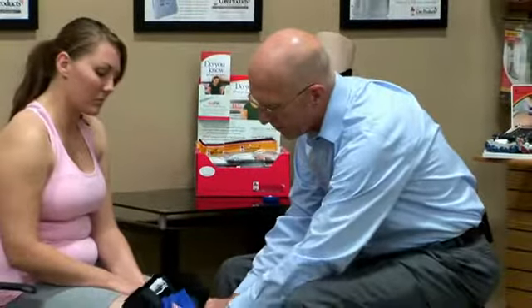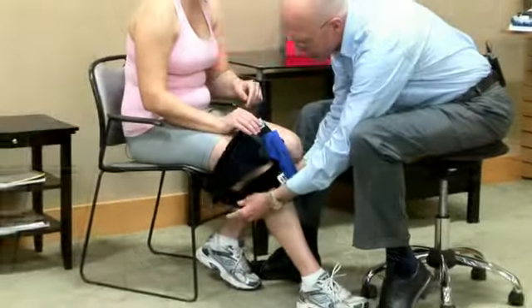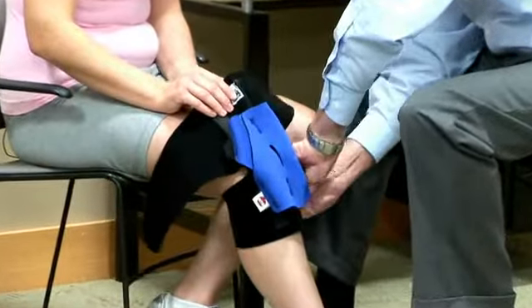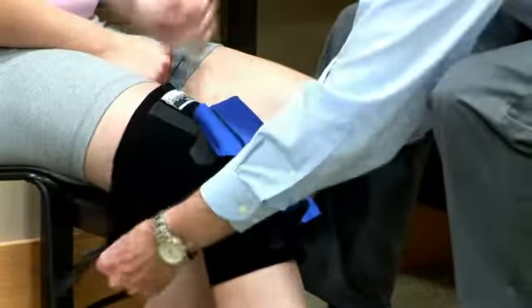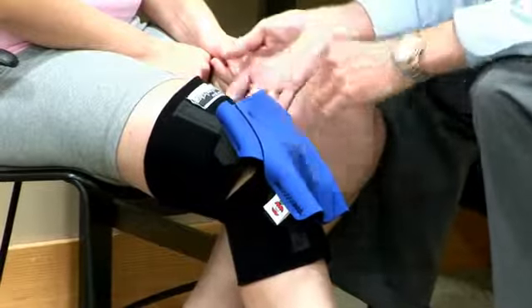We simply position the opening over the patella. We'll do the strap below the knee first — that's a circumferential wrap with simple touch closure. Then there's a strap above the knee, also a simple touch closure.